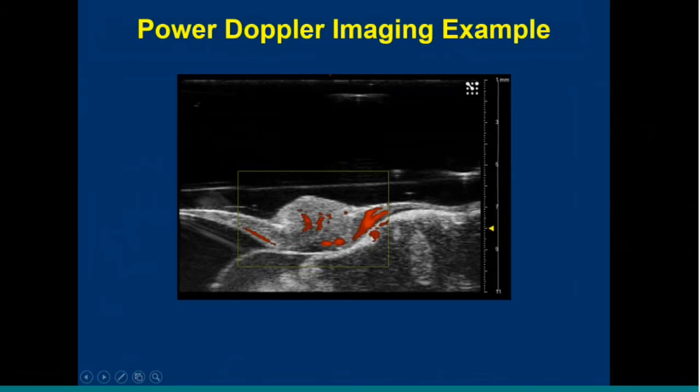To get an idea of what a 2D power Doppler image looks like, this is just a cine loop of one of our tumors. This is about 20 frames or so, so it's going to repeat pretty quickly. Just some things to note. The tumor is this mass right here. We're getting a little bit of CAM doubling, as it's termed in our lab, where the CAM kind of scars a bit due to the fact that we are inducing a wound to engraft the tumor into it. But regardless, you can see blood vessels permeating through it, and there's a lot of pulsatility. We get a different estimate of blood flow as the heartbeat of the animal goes through.